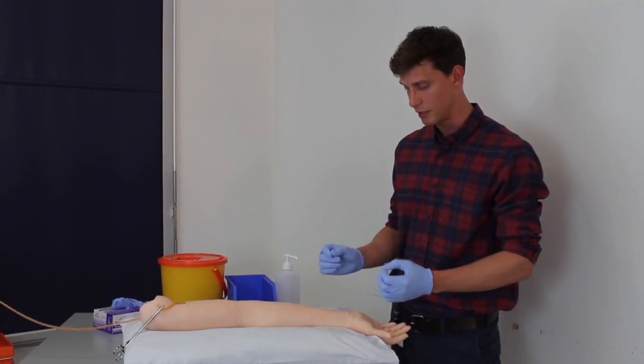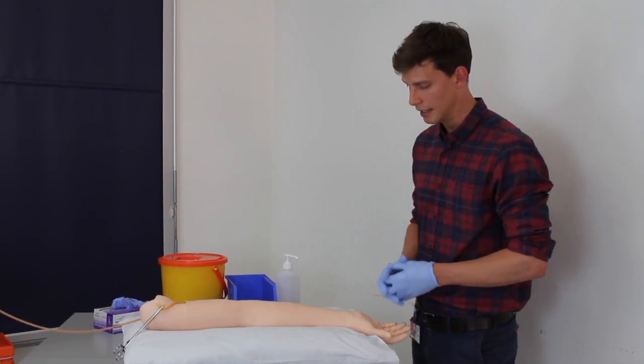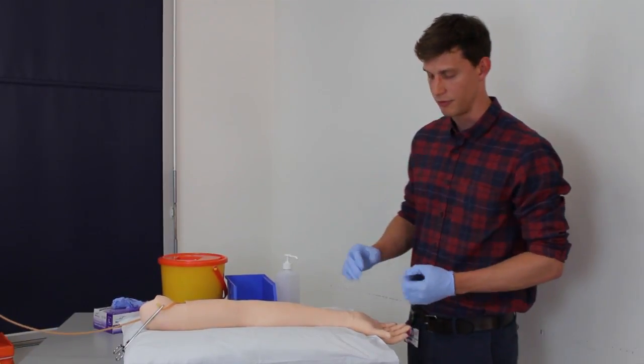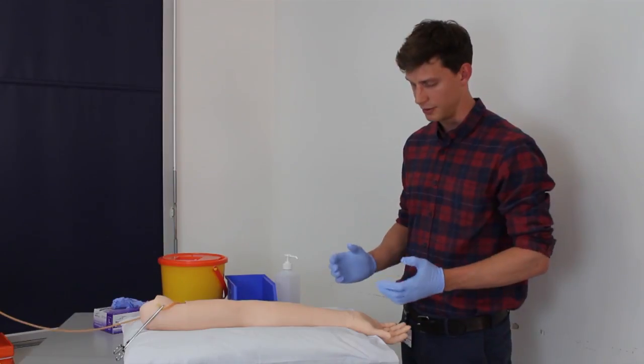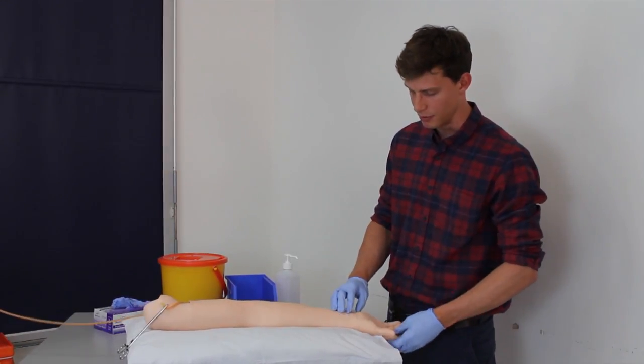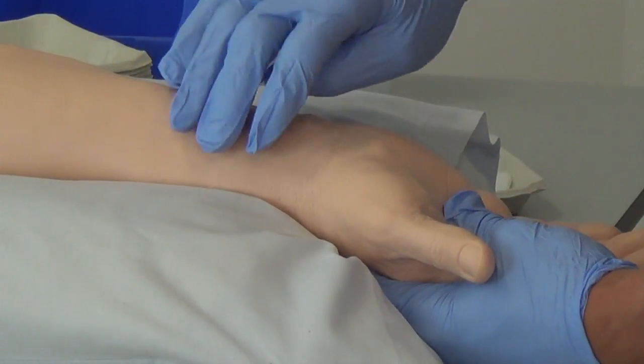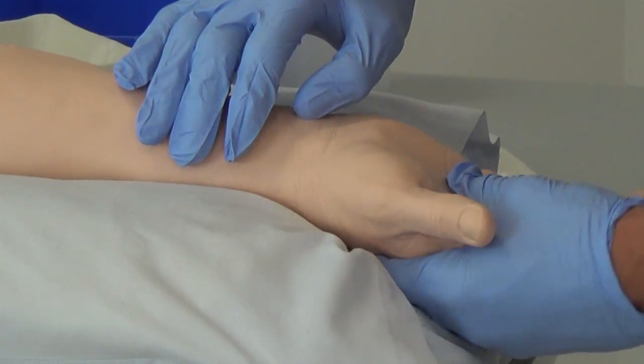It's possible to use either artery but the radial artery is usually more accessible and more prominent. Just to check that the perfusion of the hand is adequate from both arteries you can perform Allen's test. I'm going to use the radial artery, which means I'm going to palpate around the lateral aspects of the wrist.